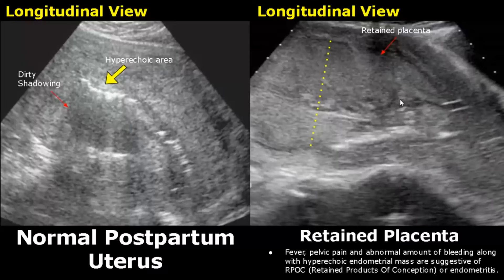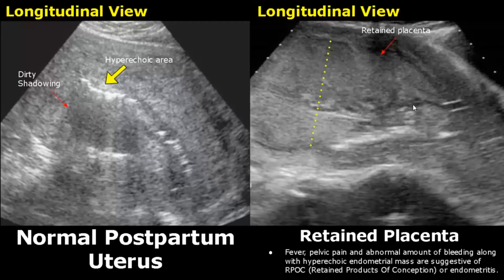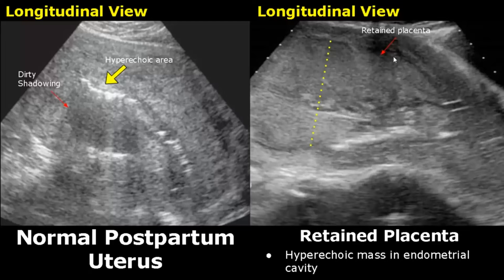Retained products of conception refer to retained placental tissue or fetal tissue in the uterus after a delivery or miscarriage. It is mostly associated with second-trimester miscarriage and placenta accreta. Fever, pelvic pain, and abnormal bleeding are suggestive of RPOC or endometritis. A retained placenta will appear as a hyperechoic mass in the endometrial cavity — we can see this large hyperechoic mass with an enlarged uterus.